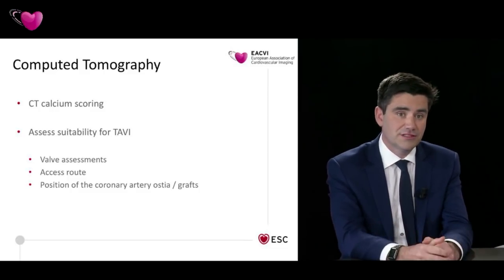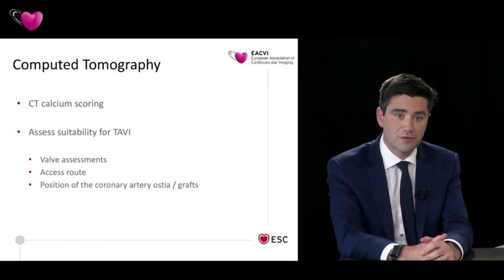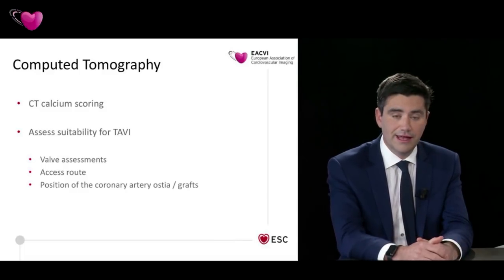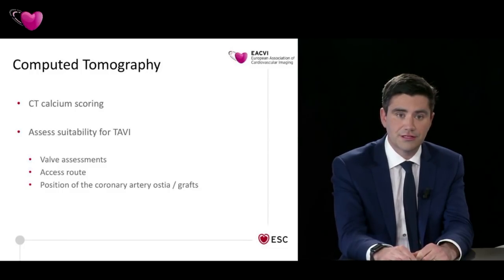And then secondly, we wanted to assess the potential suitability for TAVI versus potential surgical approaches. And so we were going to make the valve measurements, try and size potential valves, look at access routes, and again, look at the position of the coronary arteries and the ostia.